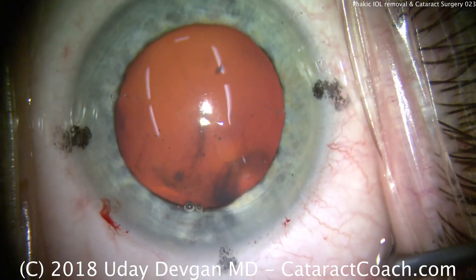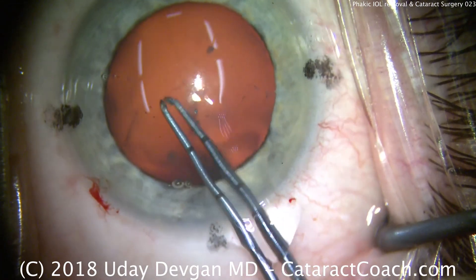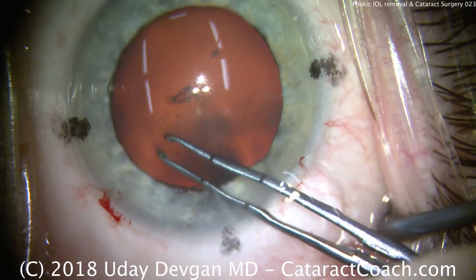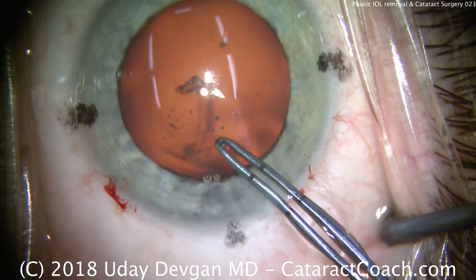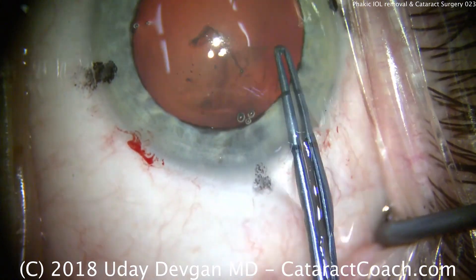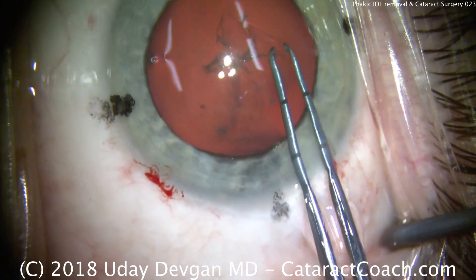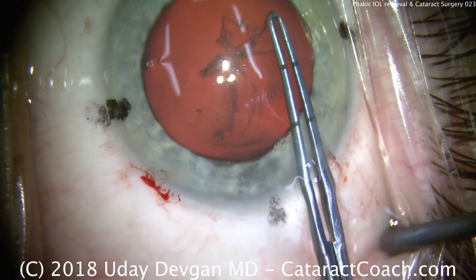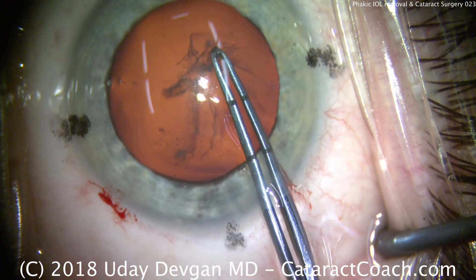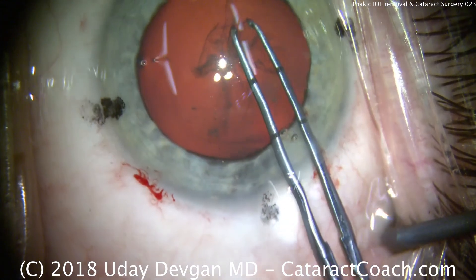We can now proceed with the cataract surgery. We'll do our capsulorrhexis here — I use just forceps, not a bent needle or a cystitome. If you look at the cornea at the left and right side of your screen, there are marks we've already placed to align our toric IOL. Those marks are along the steep axis of the cornea. Since we're operating temporally, those marks are with the rule, just off of 90 degrees. Round capsulorrhexis looks great.